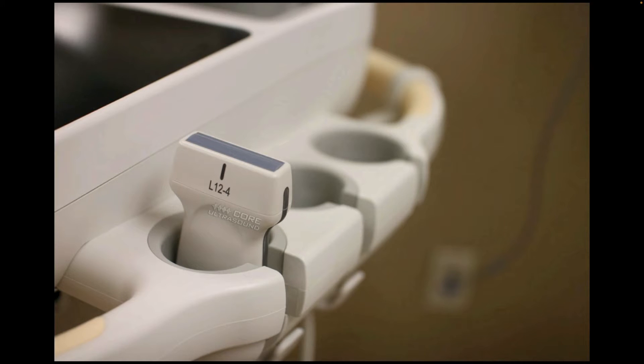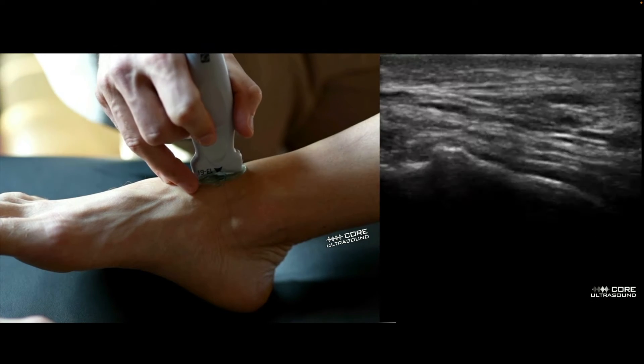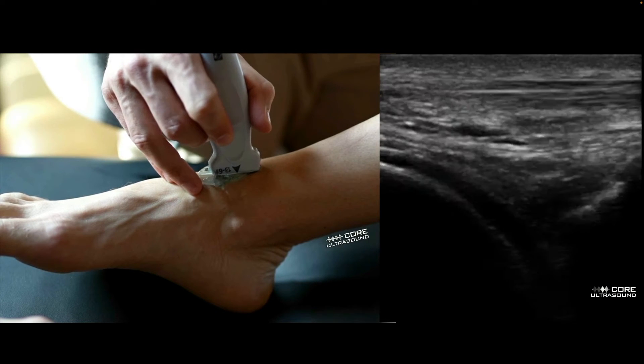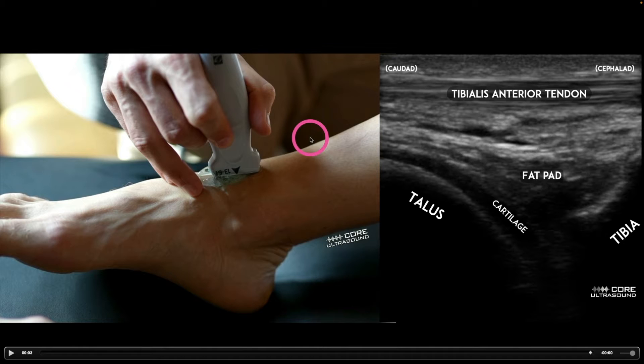Your probe of choice for this type of exam and procedure is going to be by far the linear transducer. With regards to identification, we're basically going to place it on the anterior surface of the patient's lower leg, right where the ankle starts. We have the probe marker facing cephalad, which is how we want to orient it.